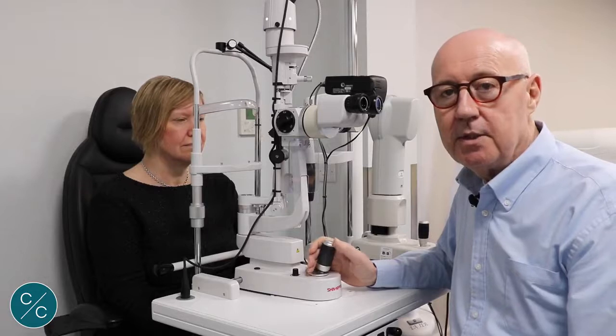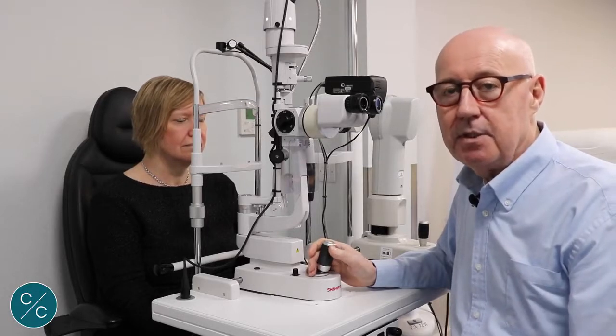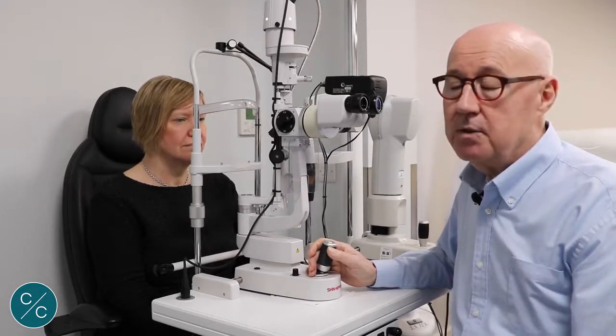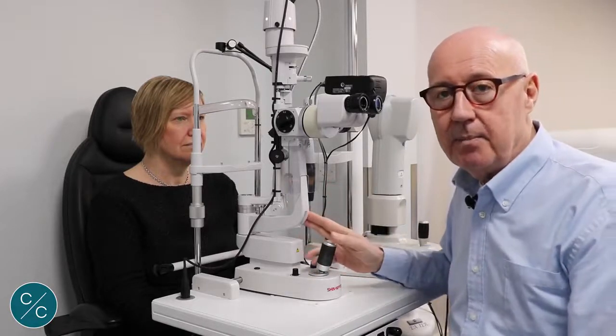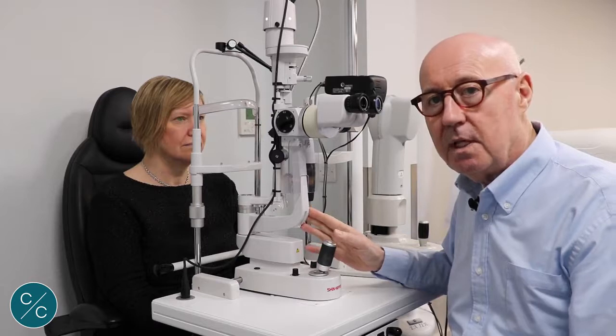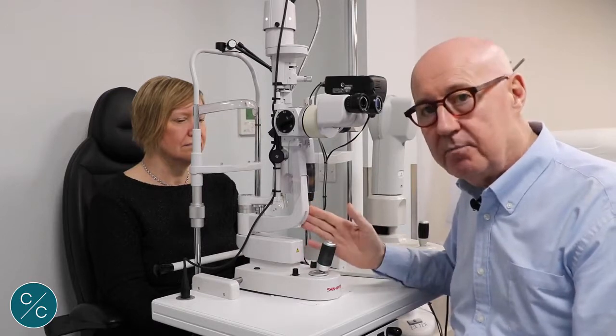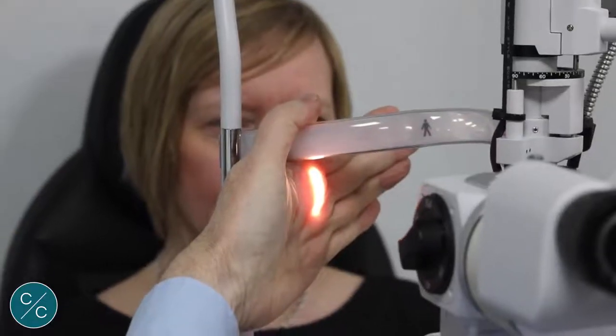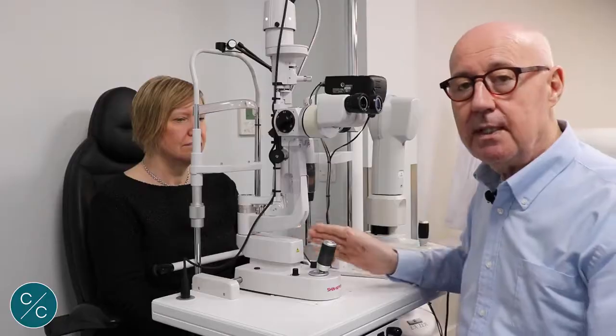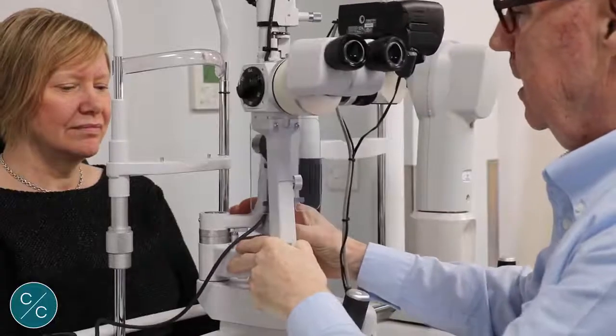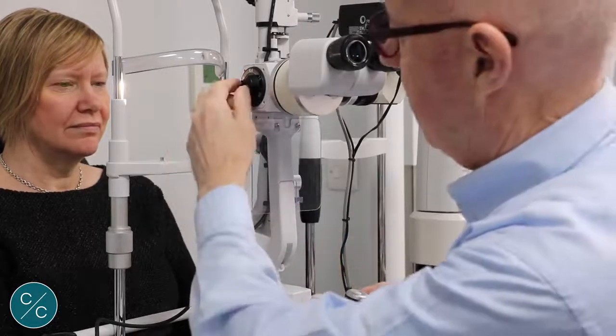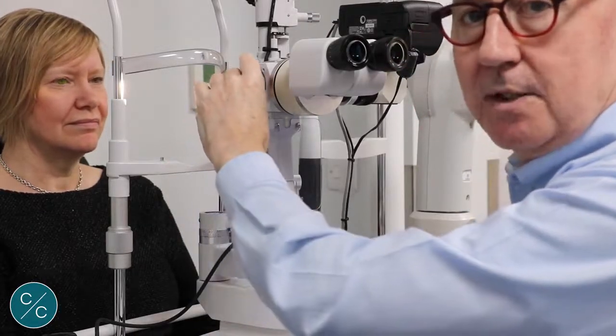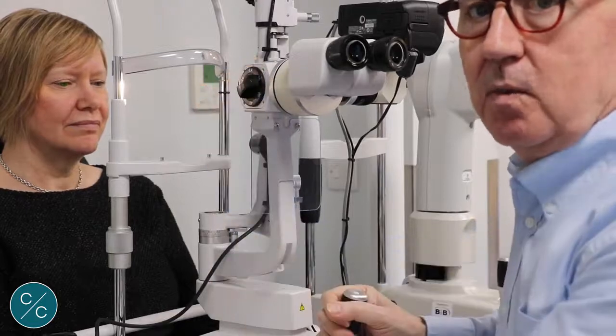When we come to look at the patient under the slit lamp to establish the central clearance, we first of all need to set the slit lamp up. We'll be viewing this time with white light despite the presence of fluorescence and we want the narrowest beam. The slit lamp also needs to be set at about 60 degrees from the light source. I also at this stage set the magnification down as low as possible until we're lined up.